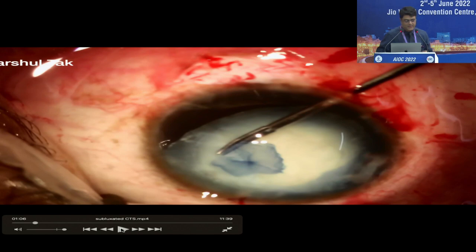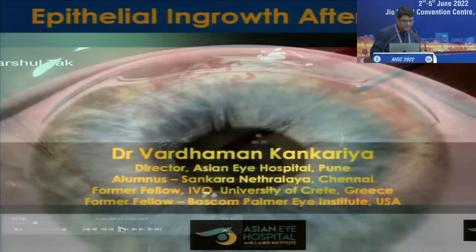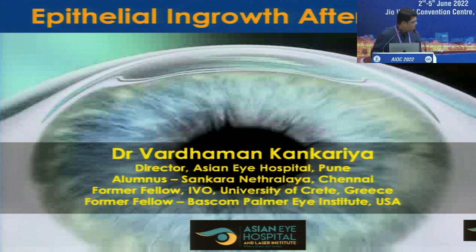Harshul? Yes. I think at this stage even a vitrector would have done a brilliant job actually. Of course micro scissors will do the job, but every time you're using the micro scissors you may not continue in the same plane sometimes. Yeah. So yes, you can do it with a vitrector, especially in the area of the fibrous part.